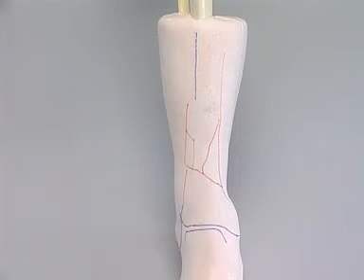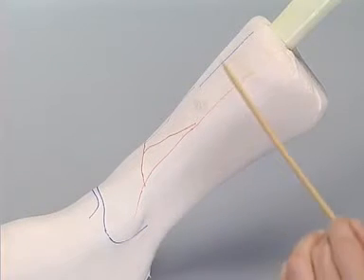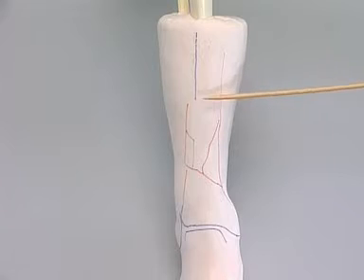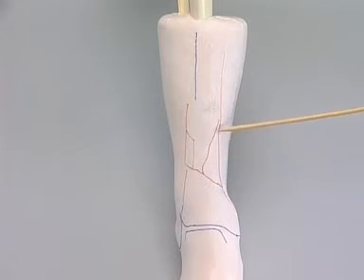The anatomical landmarks are drawn on the model. They are the joint cavity of the upper ankle, the medial malleolus, the edge of the tibia in the region of the shaft, and the approximate position of the fracture zone.